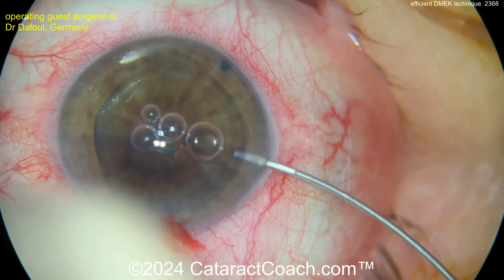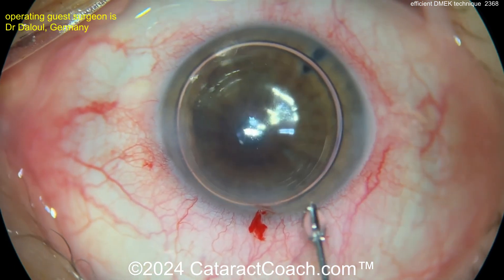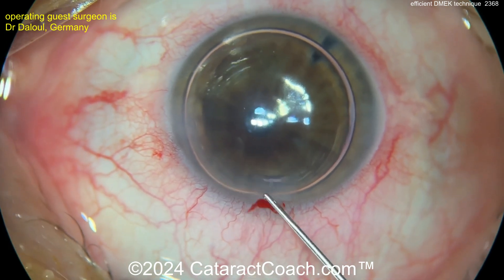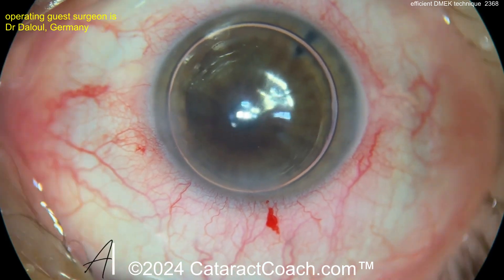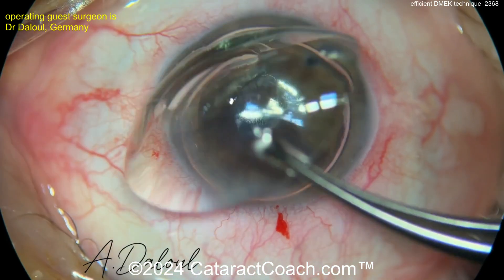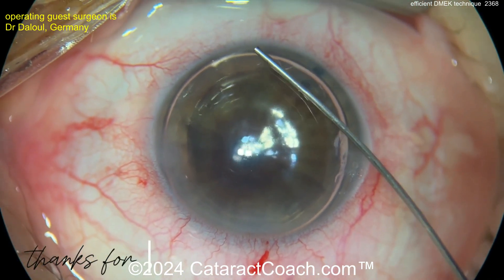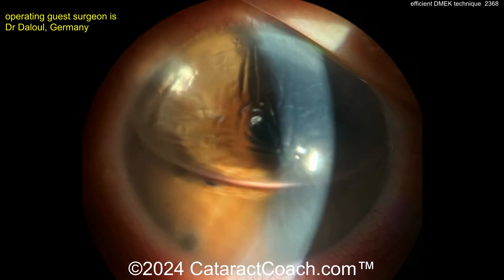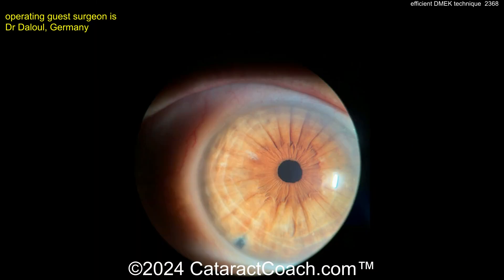Now all you need is an air bubble inside the eye. You can choose what gas you like and what concentration. At the end, sealing it up — if you want some recommendations for gas and concentrations, that's on CataractCoach.com. Just search for all the DMEK videos and you'll find it. There's a BCL placed at the end of the case. That looks fantastic. Post-op: beautifully positioned graft, the air bubble disappearing after a while, and the patient is going to have a beautiful OCT image. Look at that — restored anatomy, clear cornea, beautiful result.